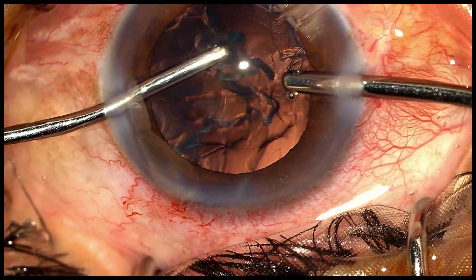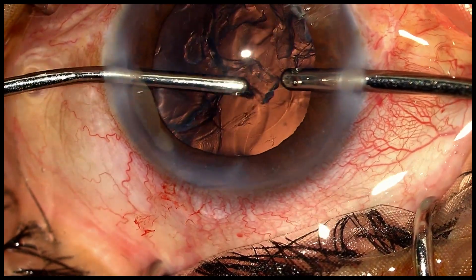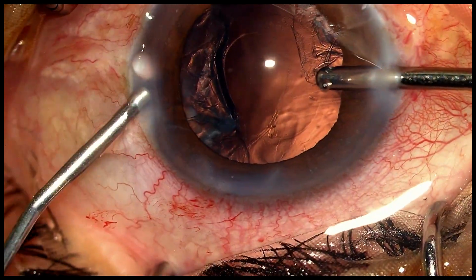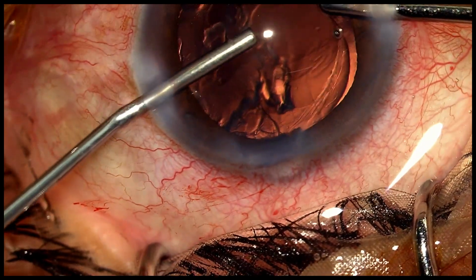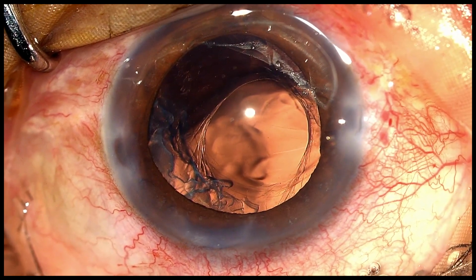This is my final attempt at attempting to remove some of the epinucleus and the cortex. At this stage, you can notice that the rent has become fairly large.